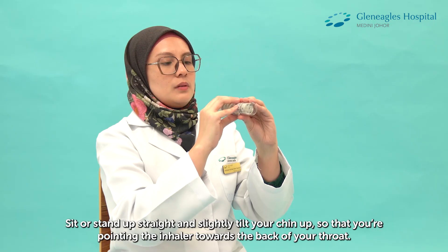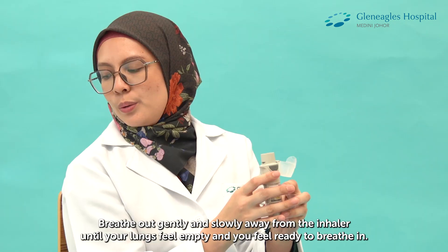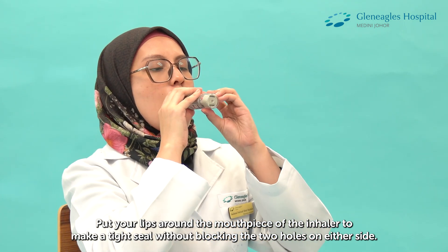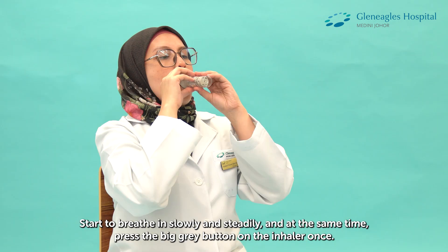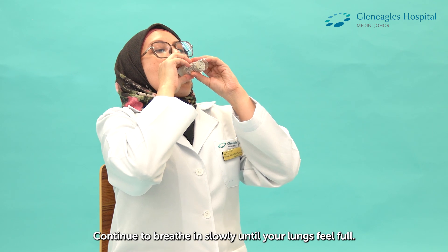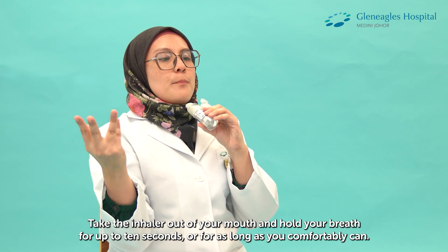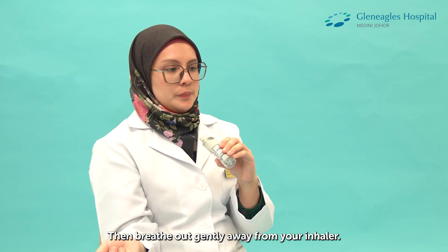Sit or stand up straight and slightly tilt your chin up so that you are pointing the inhaler towards the back of your throat. Breathe out gently and slowly away from the inhaler until your lungs feel empty and you feel ready to breathe in. Put your lips around the mouthpiece of the inhaler to make a tight seal without blocking the two holes on either side. Start to breathe in slowly and steadily, and at the same time press the big grey button on the inhaler once. Continue to breathe in slowly until your lungs feel full. Take the inhaler out of your mouth and hold your breath for up to 10 seconds or for as long as you comfortably can. Then breathe out gently away from your inhaler.